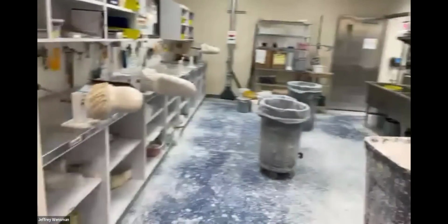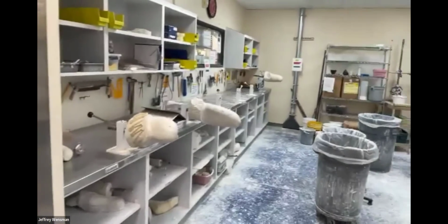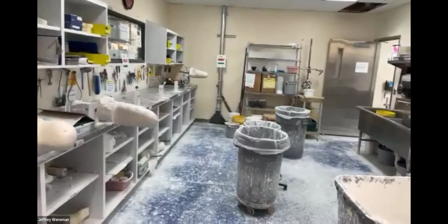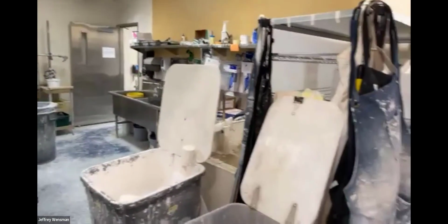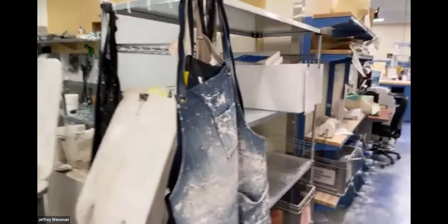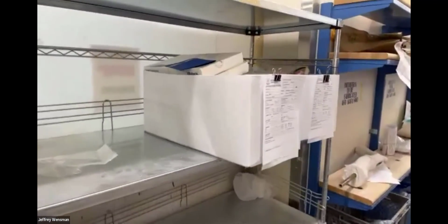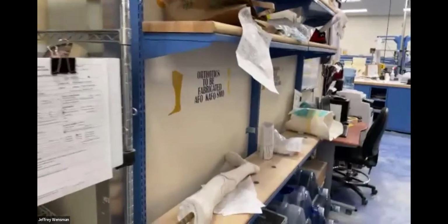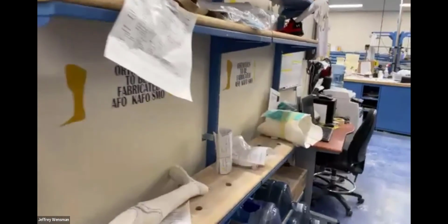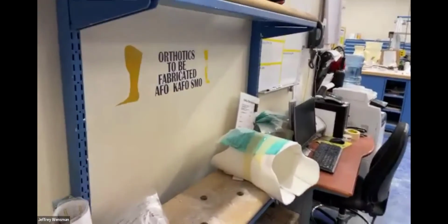This is our plaster area, which these days is used less and less as we do more and more with our carver. We've been in the digital space for about 20 years, so none of the new stuff you see out there is really that new to us. Been doing this for a very long time. And when you see this area here, this is what we call our pull system. So unlike a lot of places where you might have a manager telling you what to do each day, what we have is a system. We don't have a person.